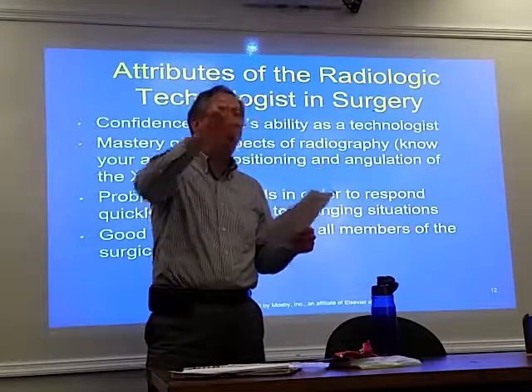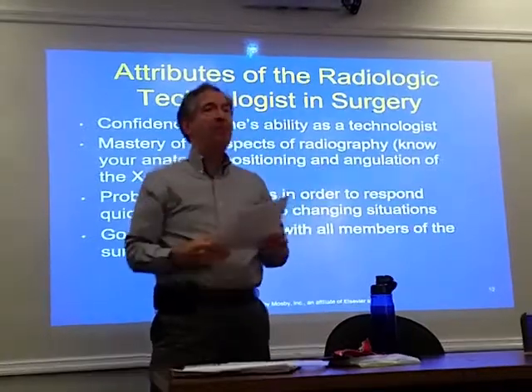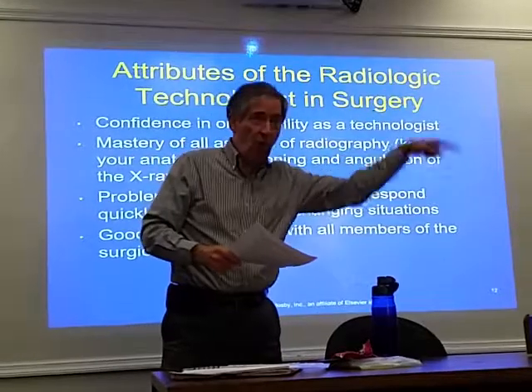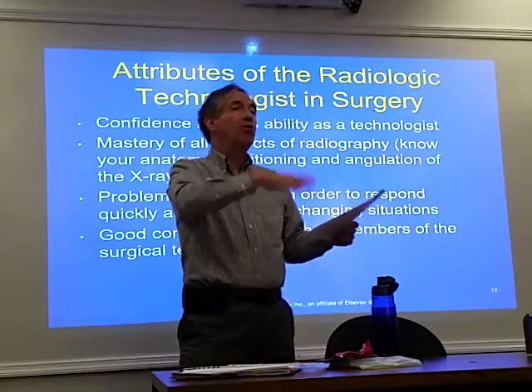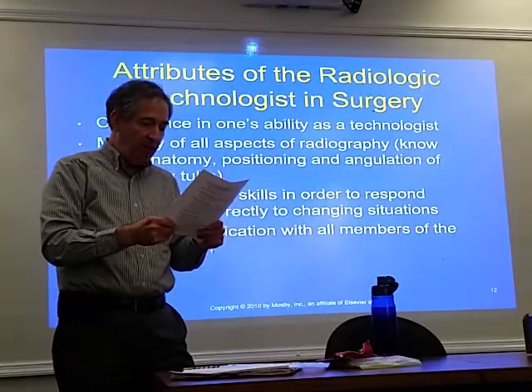If you see something in the way, there's a hemostat in the way, or there's some wires, ask for that to be moved, because otherwise, you shoot the image, and they'll say later, next time you need to move those wires out of the way, that's really distracting. It's an artifact. So they're going to be upset with you one way or the other, but they'll be more upset after the image. So I would go ahead and say something in the beginning.